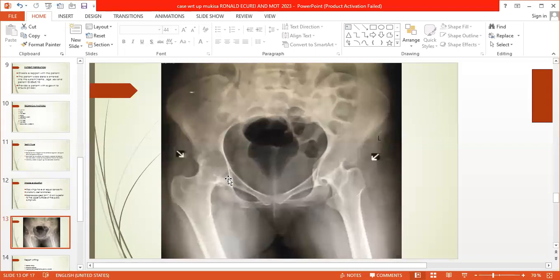And that femoral insertion, where it inserts into the pelvis, you see as if there is an attachment. There is no movement, which might either be callus formation or something else, but it's stiff. That's what is causing the patient not to be able to have movements easily, or to find difficulty in motion. You see, there was a bit of rotation.